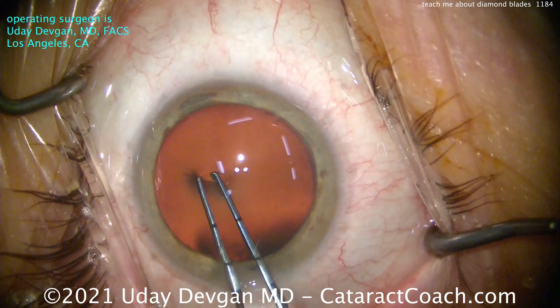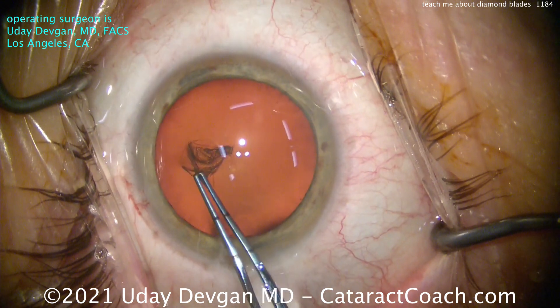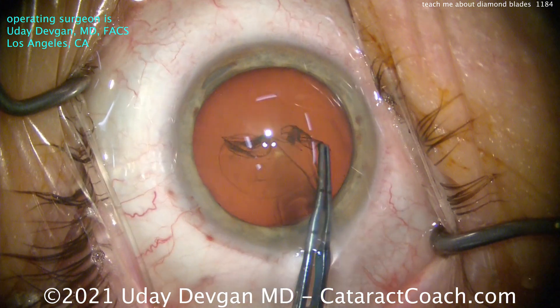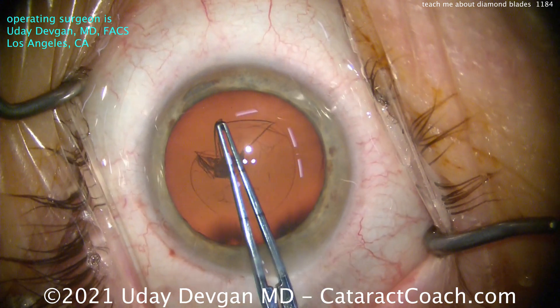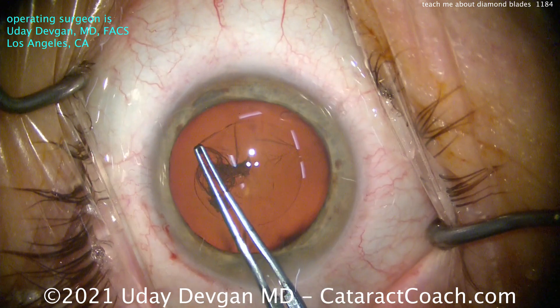You can make the incision in essentially three different ways. One, you can use a steel blade or steel keratome, and that certainly works well. Two, you can use a diamond keratome, which I've shown you here, and that's going to be the best of all — because it's absolutely the sharpest and makes the absolute cleanest incision.